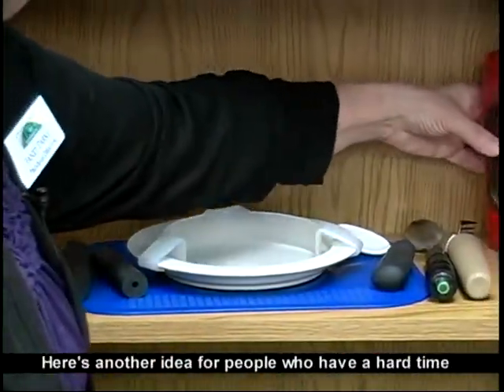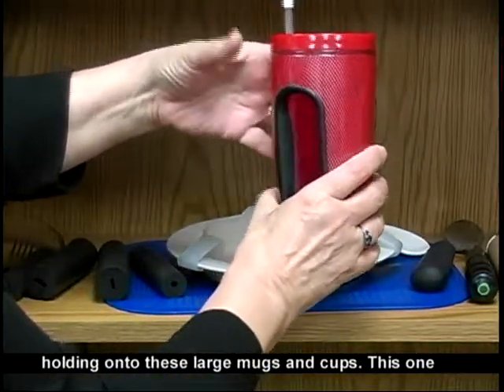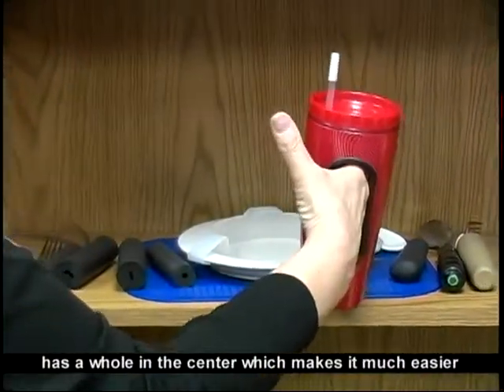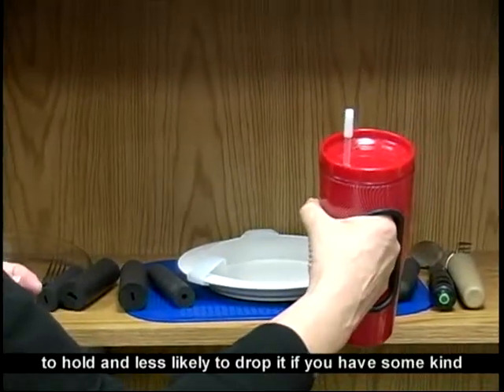Here's another idea for people who have a hard time holding on to these large mugs and cups. This one has a hole in the center, which makes it much easier to hold and less likely to drop it if you have some kind of a tremor.